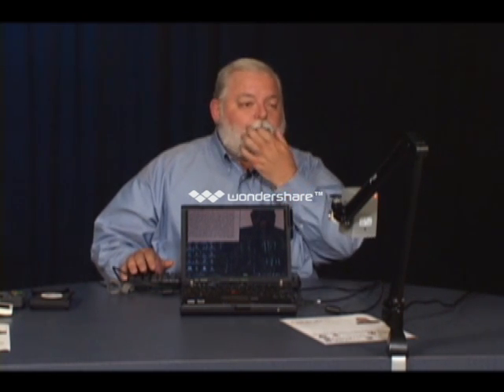Again, I can also flip the image up, down, left, right, just like we did on the other one. And I can change the colors and all those things. So you could look at yourself, you could look at, again, maybe a blueprint or something like that at any size or angle you wanted to. Point it out the window, see who's leaving school, you know, watch your neighbor, whatever you want to do, you can do that with one of these.